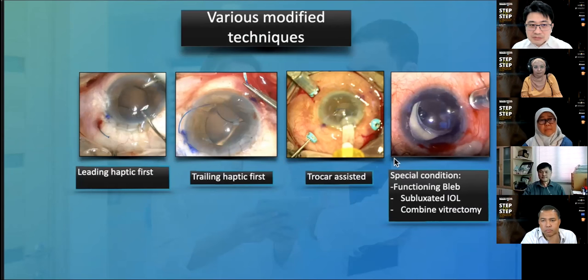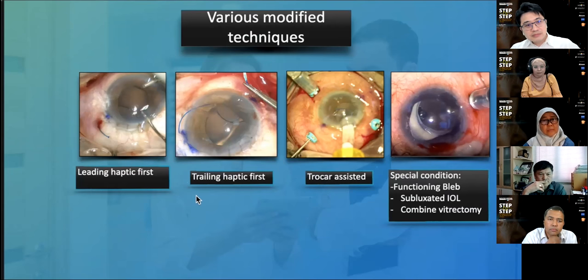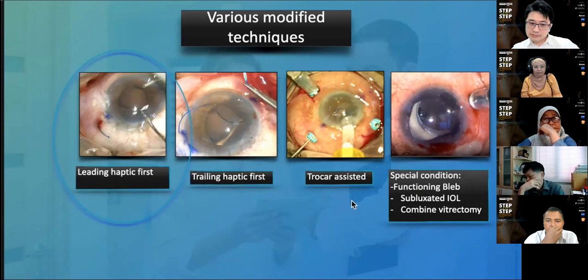So let's go through in detail the various techniques. This will be an overview of my discussion today. We'll be looking at how to deal with the leading haptic first technique. There was another technique proposed by Dr. Brian Kim to externalize the trailing haptic first. There's also a way to externalize the haptic by using a trocar. And finally, we'll look at some special conditions whereby we'll probably be using some mix and match technique. Now, let's look at how we deal with the leading haptic.